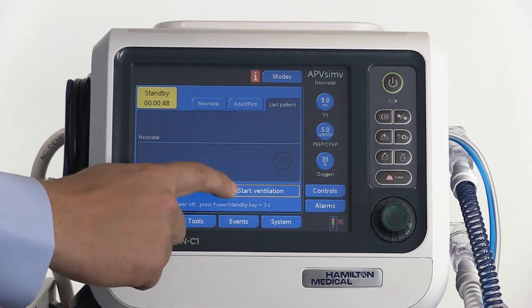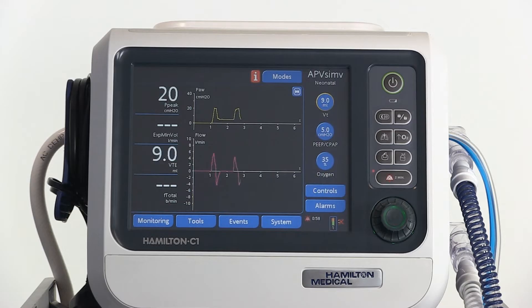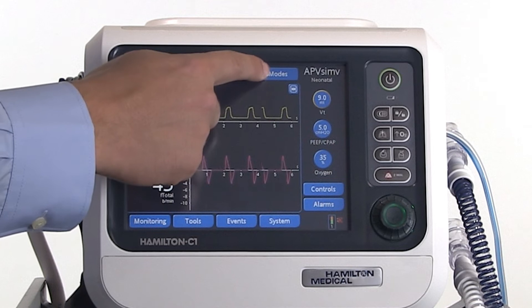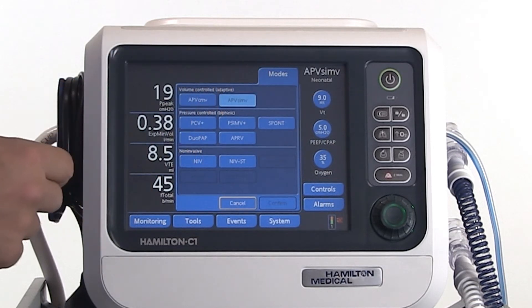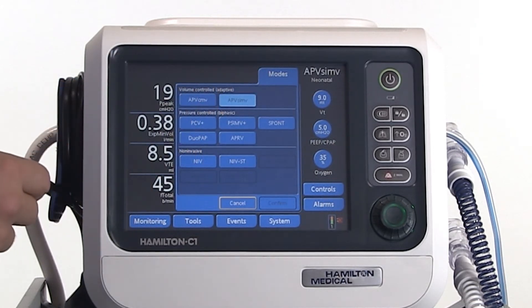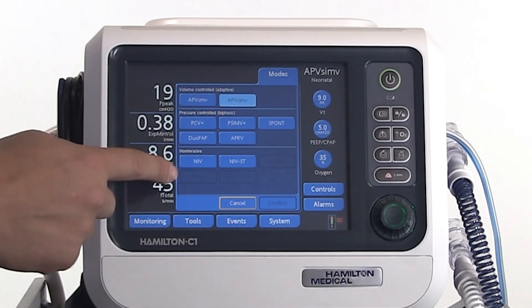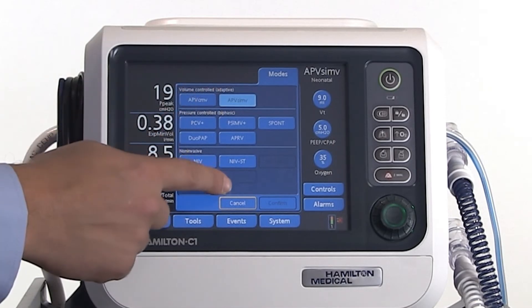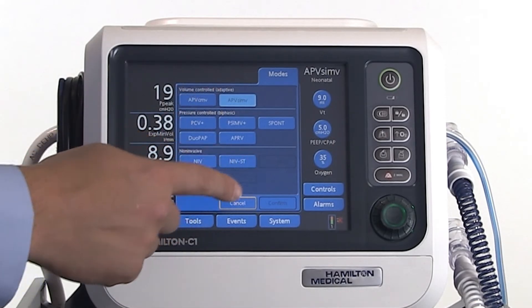Now you are ready to start ventilation. Please note that while ventilation is running, you can switch to any other mode except to NC-PAP, NC-PAP PC, or high flow oxygen therapy.